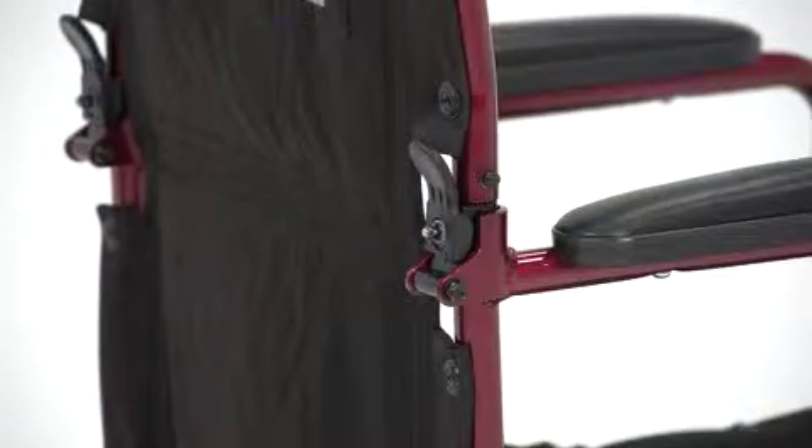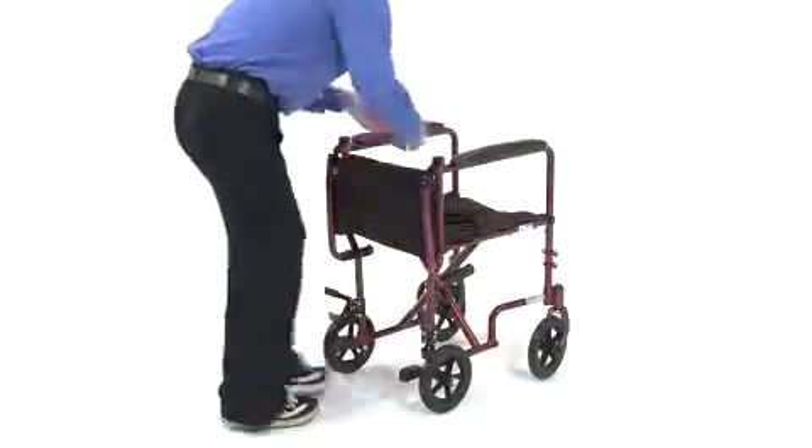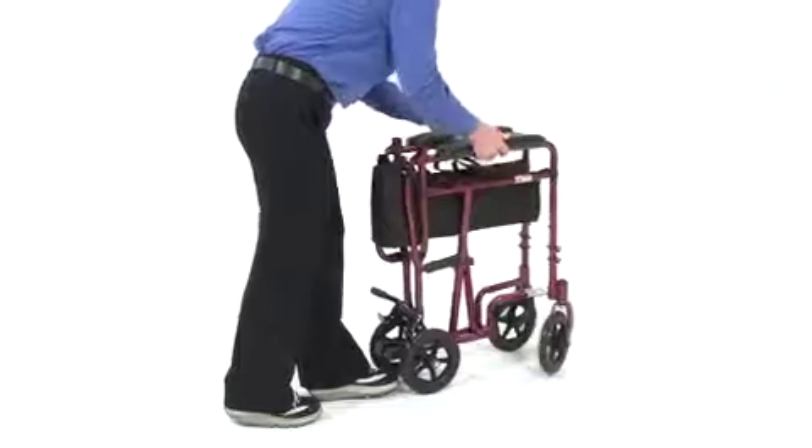To transport or store the chair, pull locks simultaneously and carefully fold down the back support. Then pull up the side seat straps.